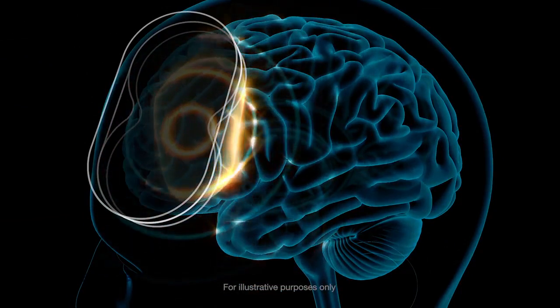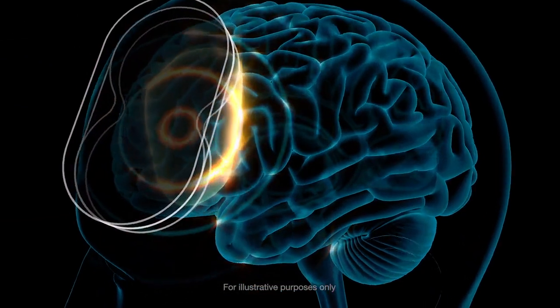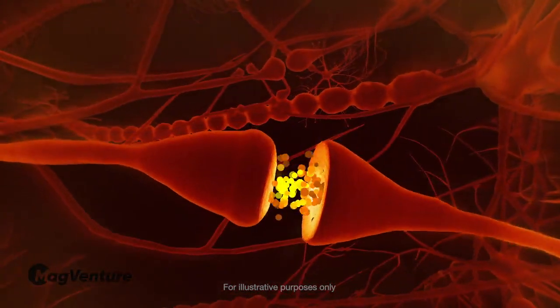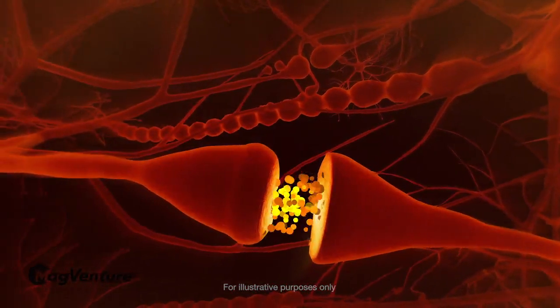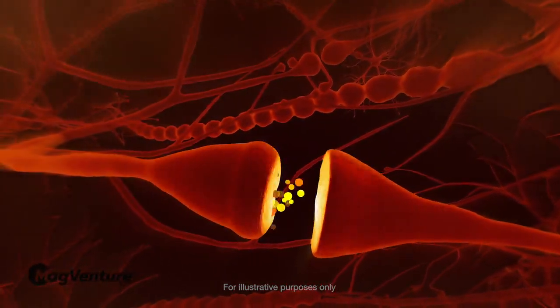MagVenture TMS Therapy is a safe, FDA-cleared, non-invasive treatment that uses short magnetic pulses to target the exact areas in the brain affected by depression, stimulating and strengthening these neural pathways.